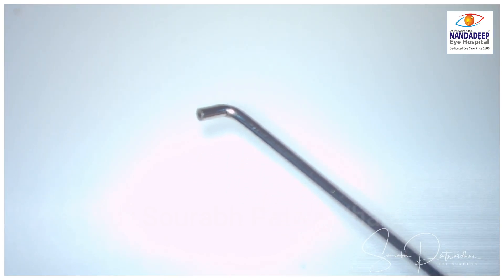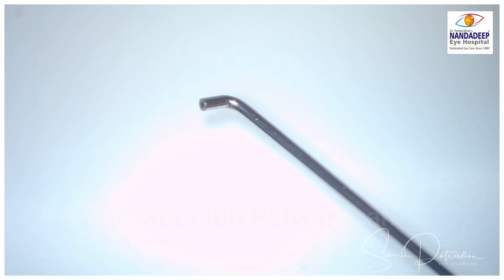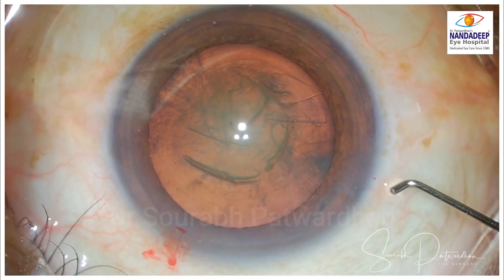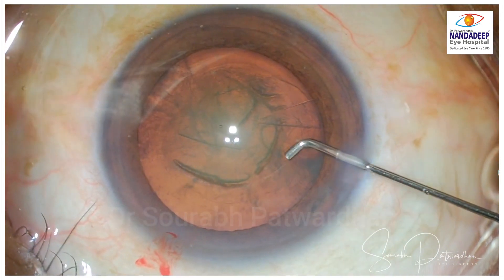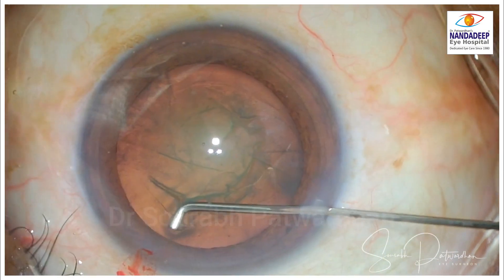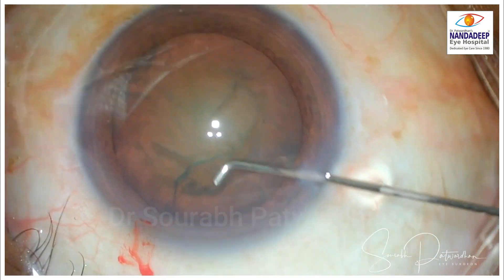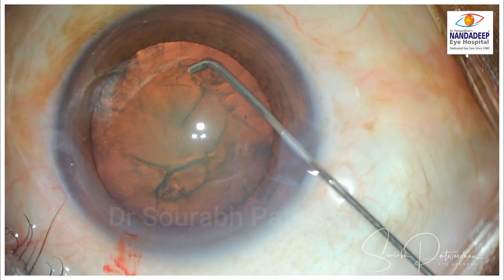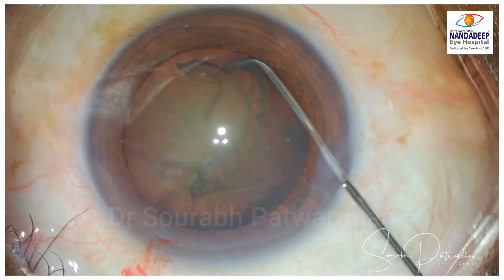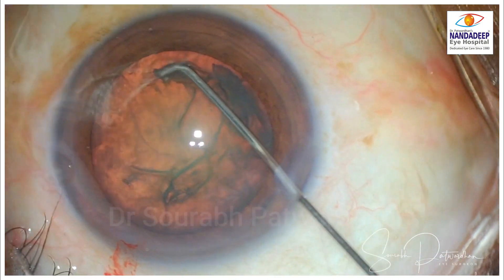This is Dr. Tak's modified hydro dissection cannula — it's a 27 gauge cannula with a nice smooth bend 1 mm from the distal end. This is my first case using this cannula, and there it goes under the capsule. You get a nice fluid wave, and I find it very convenient to use this small bent tip for dialing the nucleus after hydro dissection.